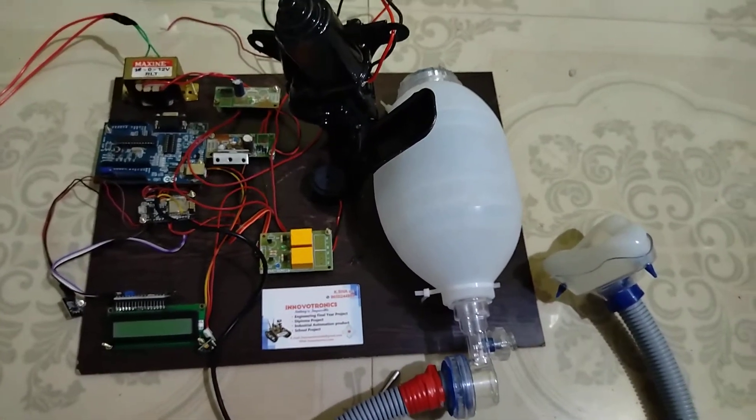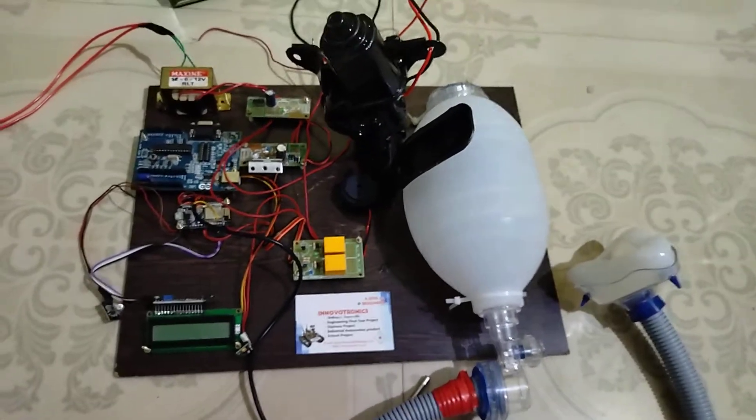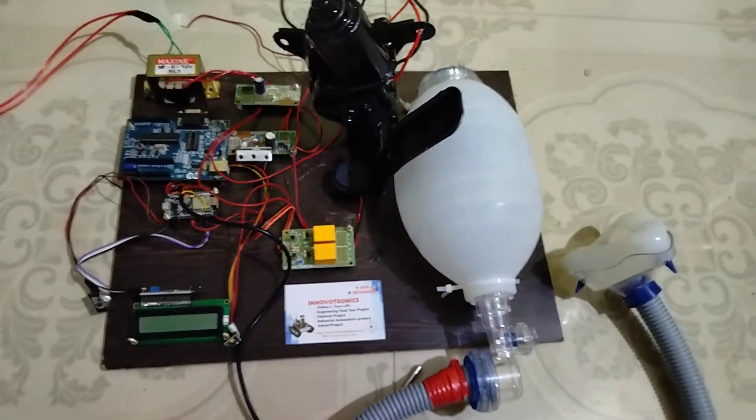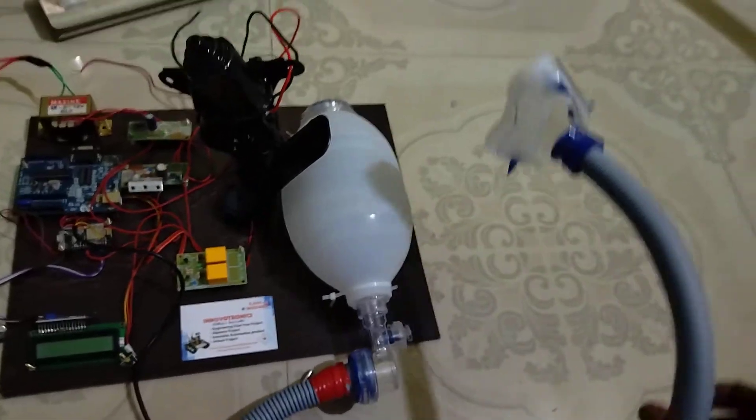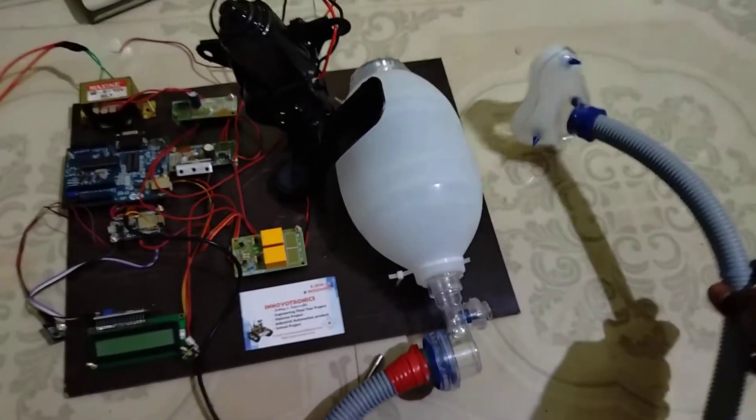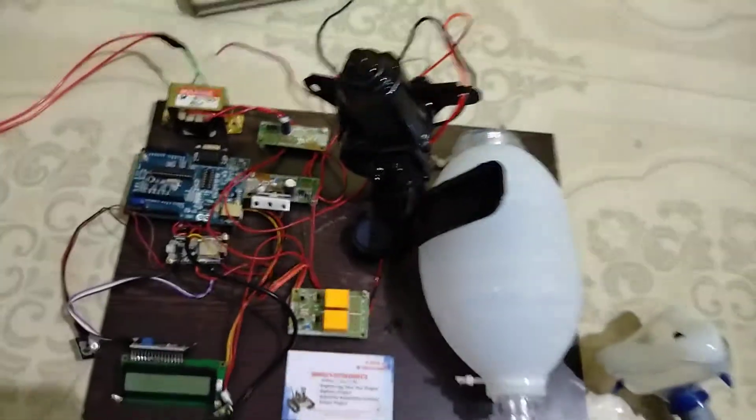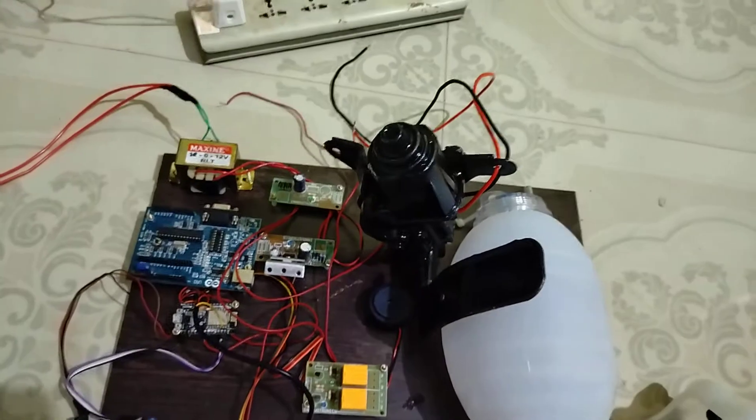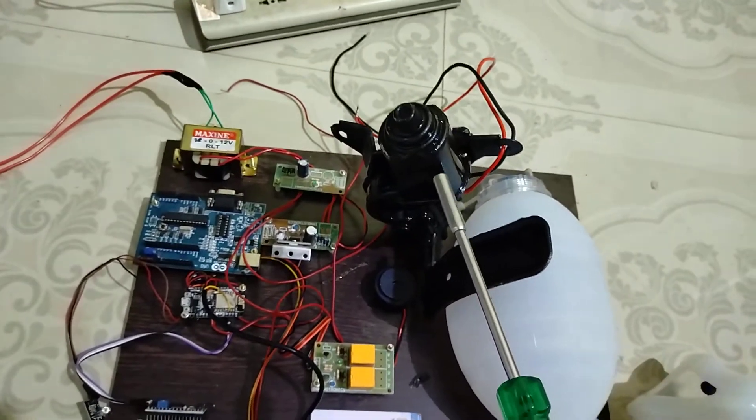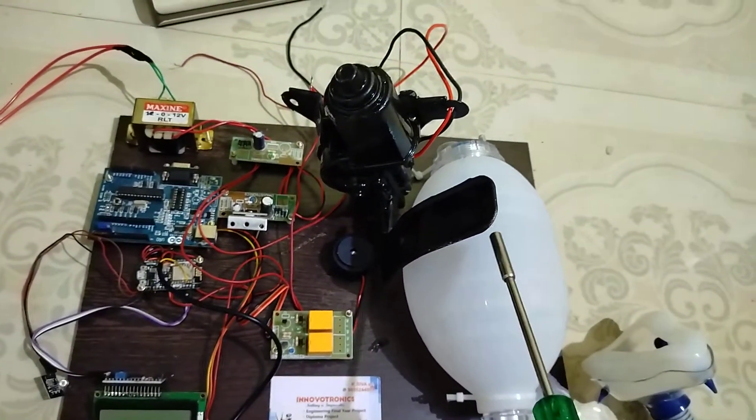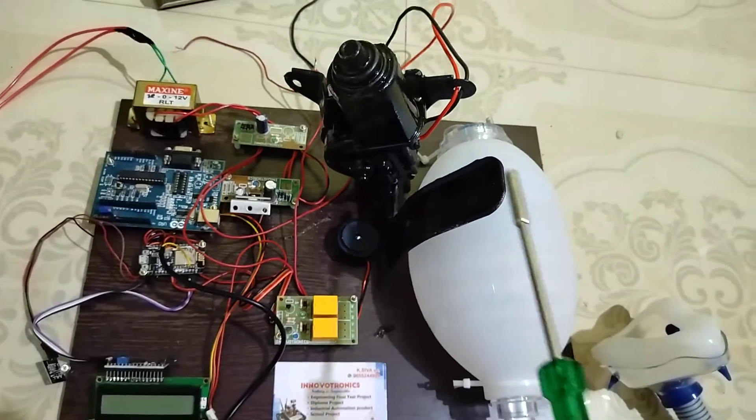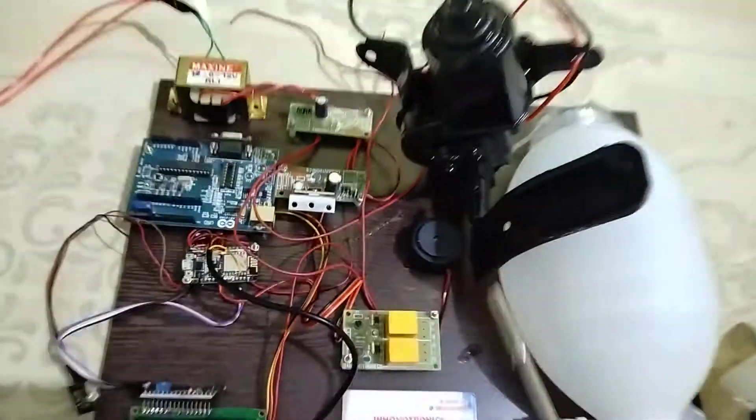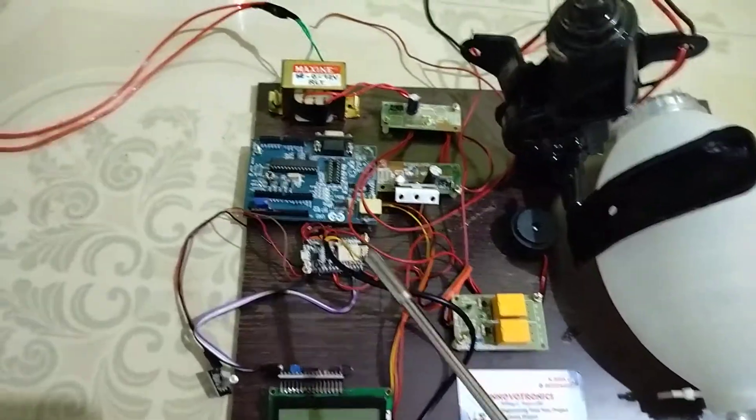This means we can avoid human death. This is the prototype ventilation system for ICU patients. This is the PVC hose for the patient, and this is the motor. This motor is used to push and pull the air balloon using this mechanism.